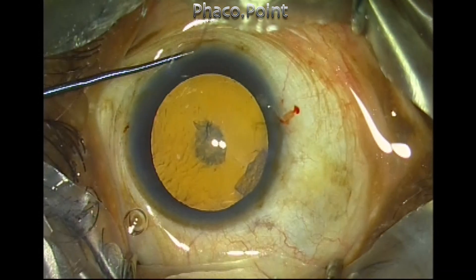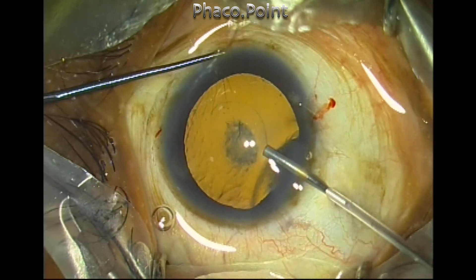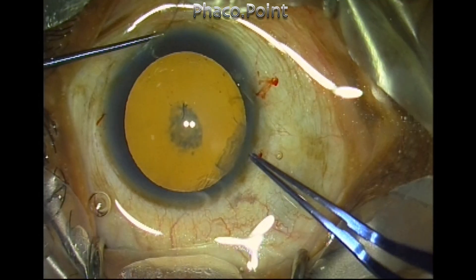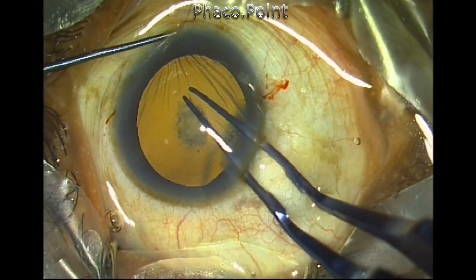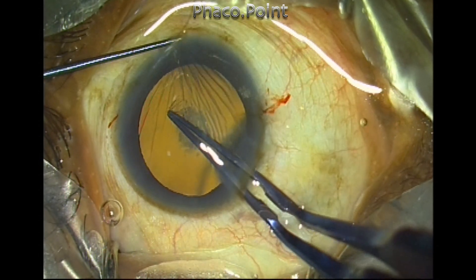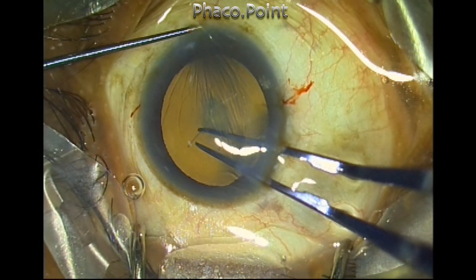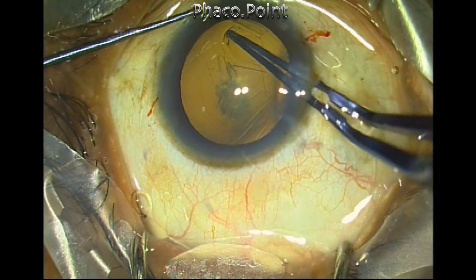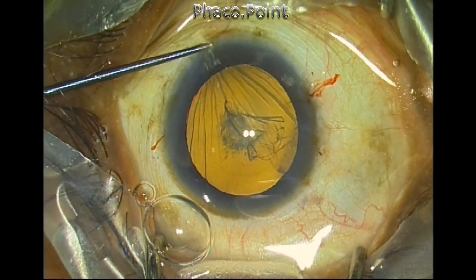As I perform the capsulorhexis, the patient is trying to squeeze — this is evident from the radial folds that appear on the cornea as the eye becomes more hypotonic. However, the pocket incision helps you to maintain the eyeball in the straight-ahead position even in patients who have a very prominent Bell's phenomenon.